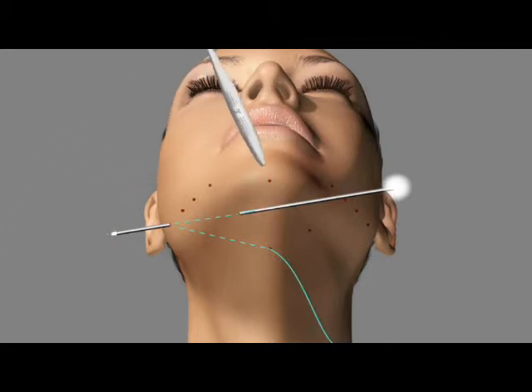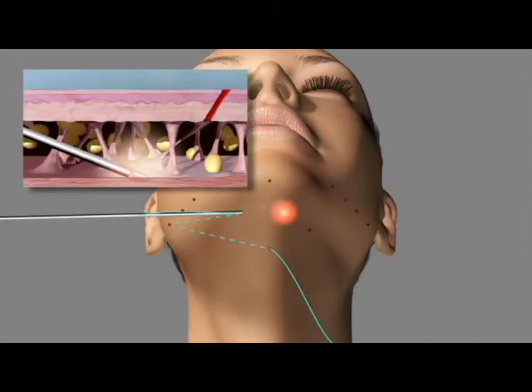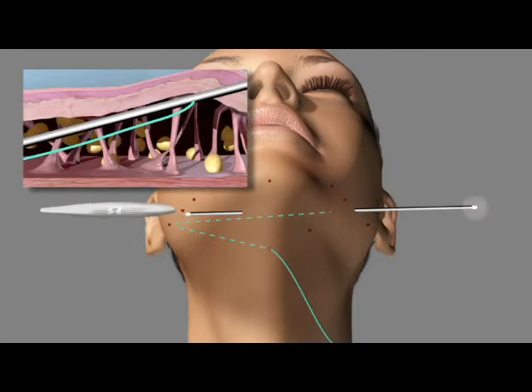The suture matrix is weaved in a crisscross fashion, going to every other mark as the suture is advanced anteriorly towards the submentum. Eventually the suture will be brought out through the submental stab incision where the liposuction access was obtained, as well as tunneling access.